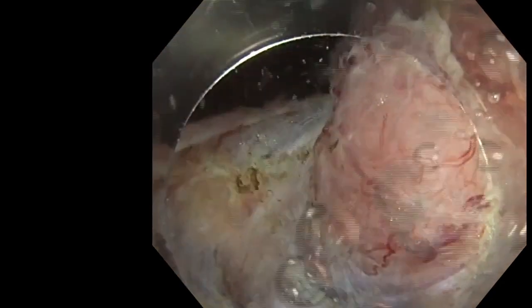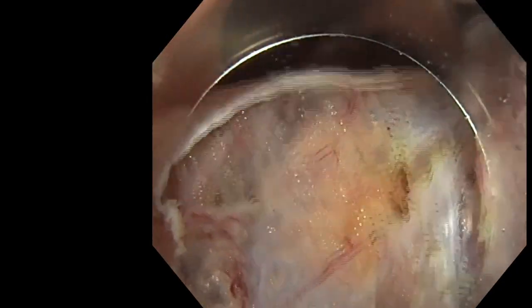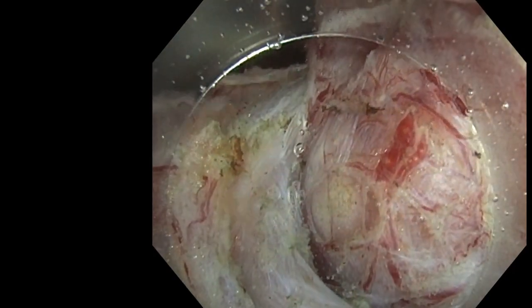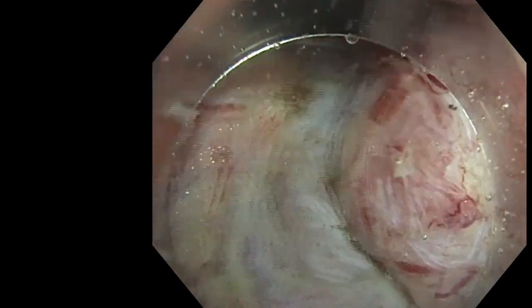I mean, injecting this small space between the muscular or the bottom of the diverticula or the bottom of the appendix and the mucosa we want to remove with adenoma. And we can find a layer, even if it's small. It's feasible to remove this layer.